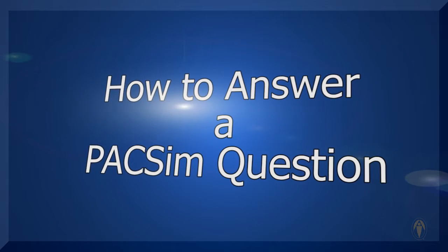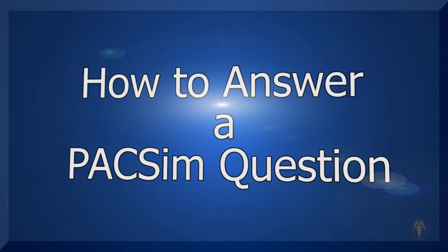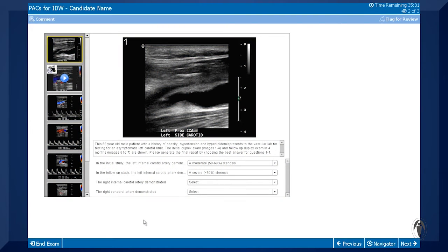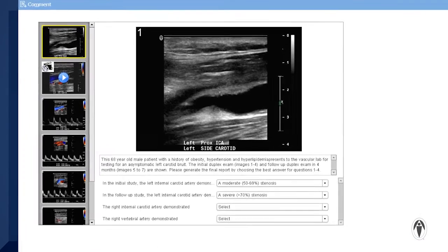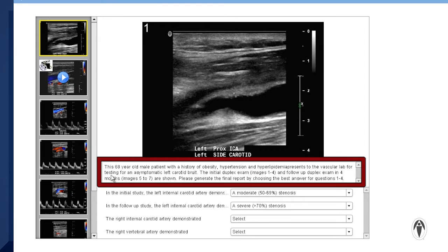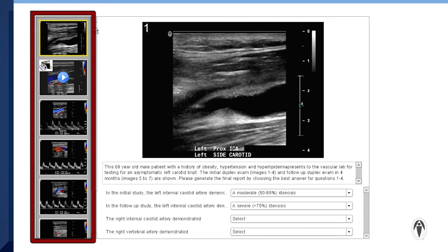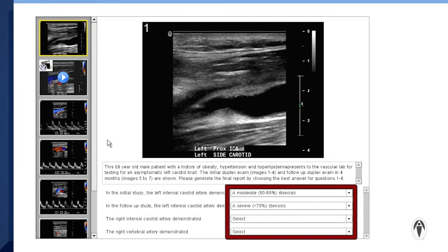This video explains how to answer a Picture Archiving and Communication Simulation (PACSIM) question. The ARDMS's PACSIM question is designed to simulate a reading workstation experience. Each question presents a brief case description or clinical history and a collection of images. You will be required to evaluate all the existing images and complete the impression for the ultrasound examination by selecting the response options from the drop-down menus.